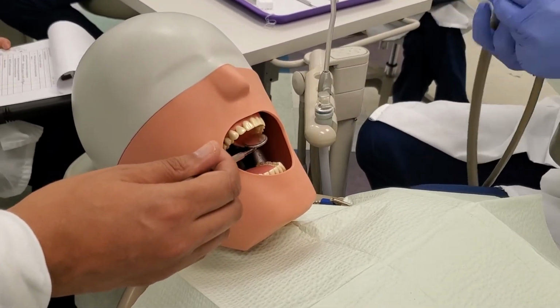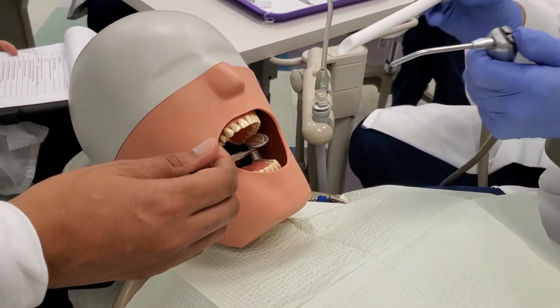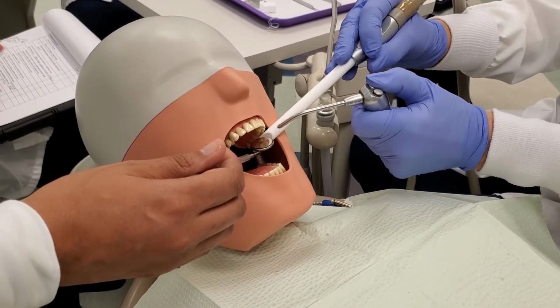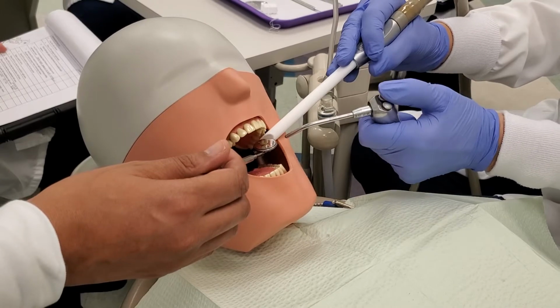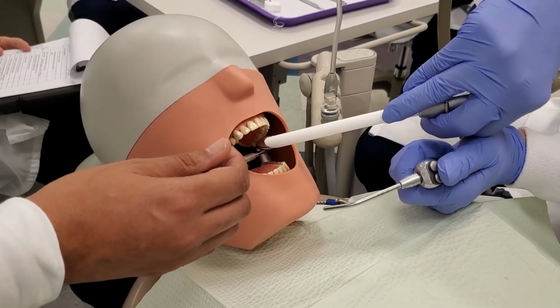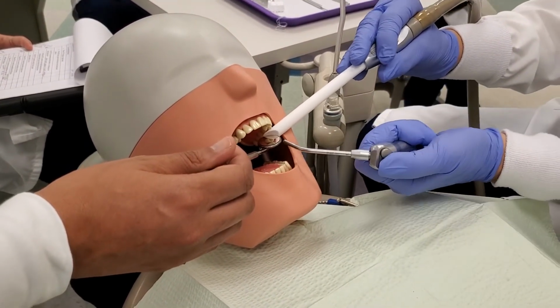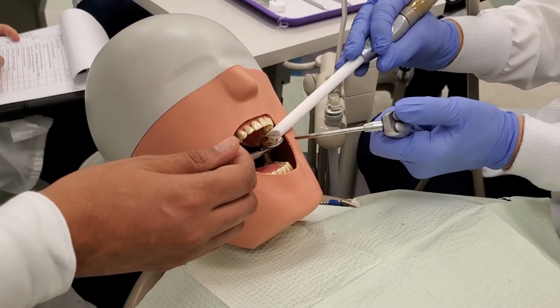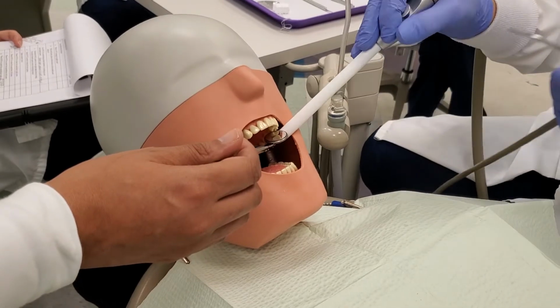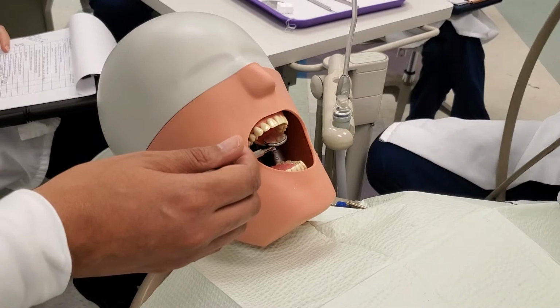So I'm going to have you clear the mirror. So how are you going to clear the mirror? Again, you'll have it in the pen grasp, and I'm just going to have you rinse it with some water, and then we're going to dry it with the air. And I just want you to show me where this is. This is going to be right here. Not in the doctor's way, not here. It's going to be over here, so he can still see what he's doing. And anything that I'm rinsing off the mirror, hopefully, most of this will be catching it, and then you'll dry it. Okay? And then again, coming back and making sure that they're not choking on anything.